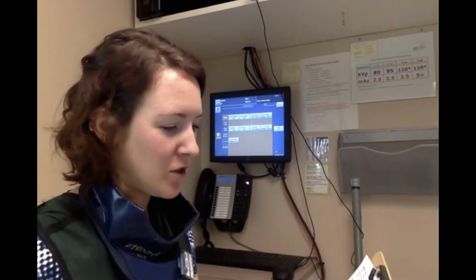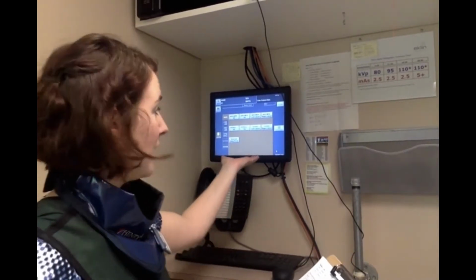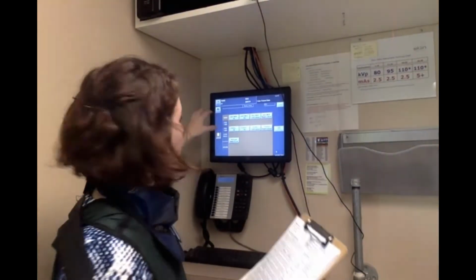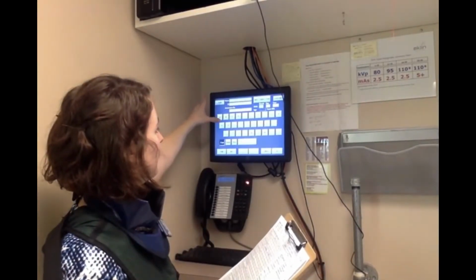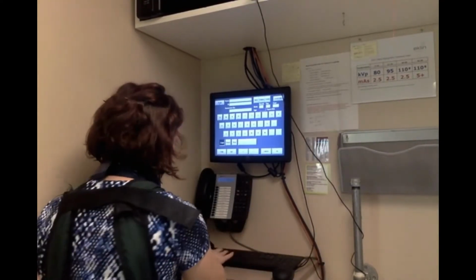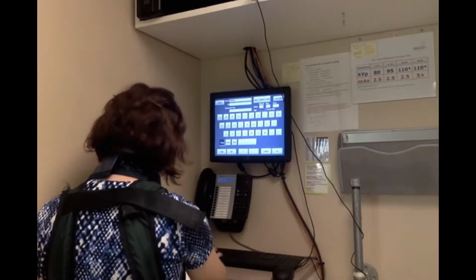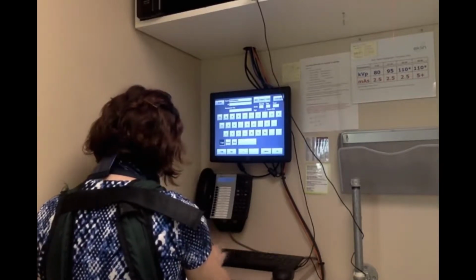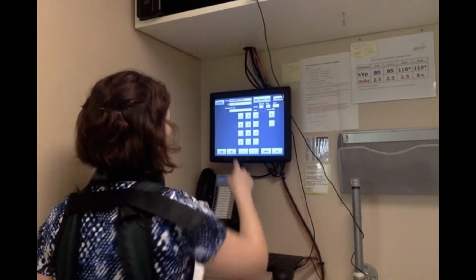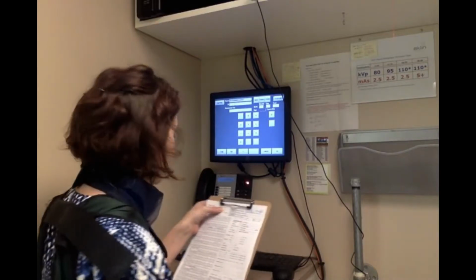Alright, so I'm going to show how we label our x-rays. We have a digital radiography machine, so I'm just going to put the patient information straight into the computer. So I'm hitting the patient button, and I'm going to put in his name, and we do last name first, so we're taking pictures of Mr. Lucky Gossman, so Gossman. I'm going to do a space, Lucky, with his first name, and then for ID we have our own 5-digit hospital ID code that we always use.